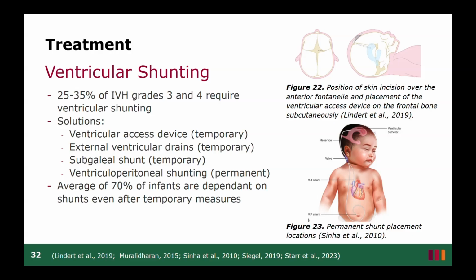External ventricular drains are placed into the right lateral ventricle via a hole in the skull and allowed to drain outside the body through a catheter. The exact location is determined by the surgeon, however, the frontal horn of the right lateral ventricle is most commonly used. In cases of asymmetrical hydrocephalus, the proximal shunt is placed in the larger of the two ventricles. A subgaleal shunt is used when the infant cannot tolerate another temporary shunt. A pocket is created in the subgaleal space between the skull and the skin, which collects the CSF from the ventricles. This collection creates a fluid-filled bulge on the infant's head.